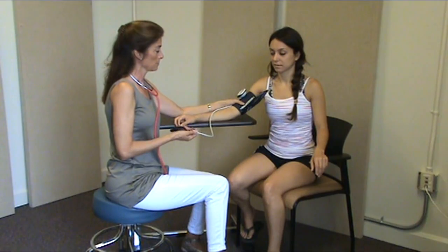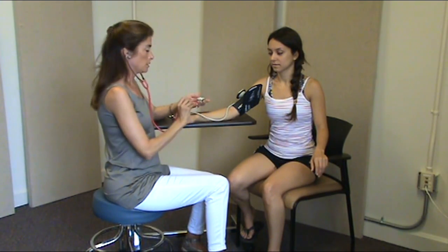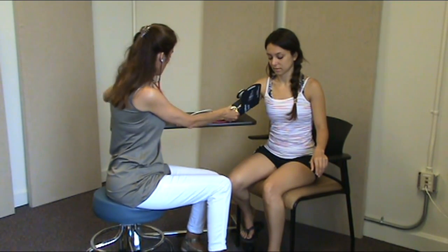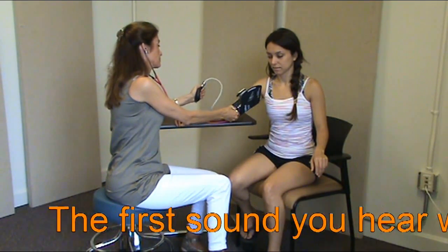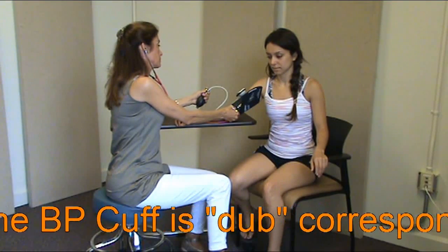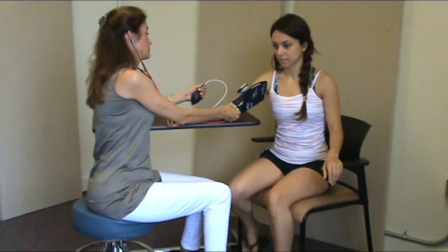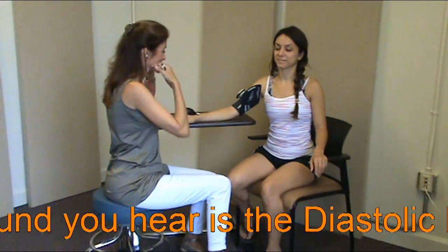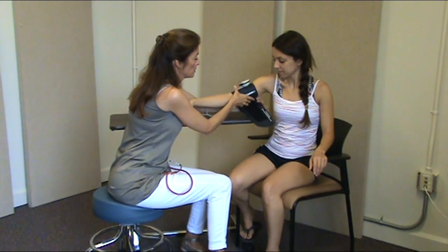Completely deflate the cuff so that then you can check and auscultate the blood pressure. You're going to place the diaphragm of your stethoscope right over the brachial artery. And again, inflate and slowly release. You are 110/62. Perfect. Make sure that you completely deflate the blood pressure cuff and then remove the blood pressure cuff from the arm.